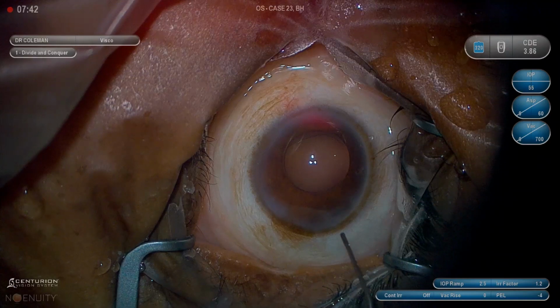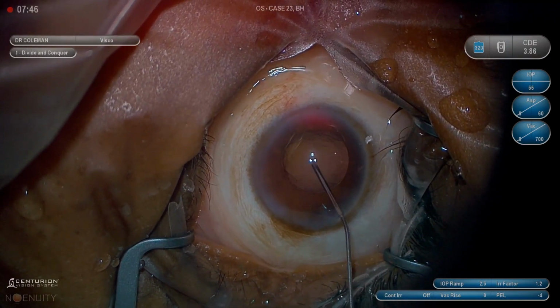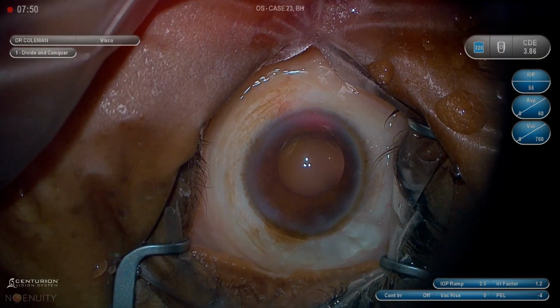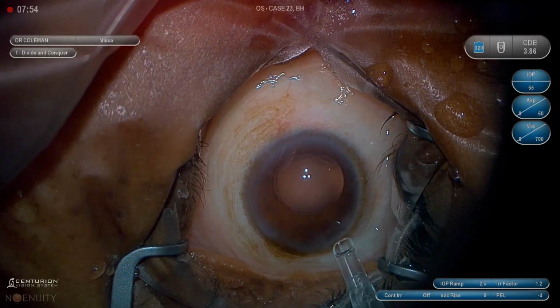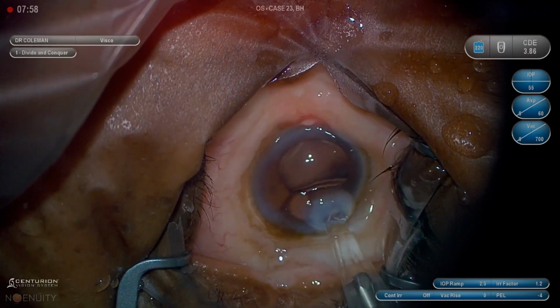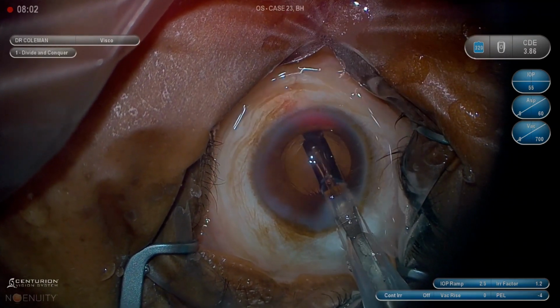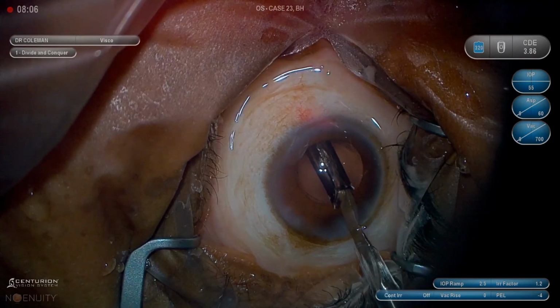I think there's some debate over whether we're just waiting longer and the time you're sitting there causes edema to happen anyway. I really feel like that's not the case, that tetracaine actually has some sealing effect through whatever mechanism, but it's been a great trick. It's saved me a whole lot of sutures. But I think the question of whether to put a stitch or not is, if you've done those things and it's still leaking, or you think it's unstable and you think about putting a stitch, put a stitch.